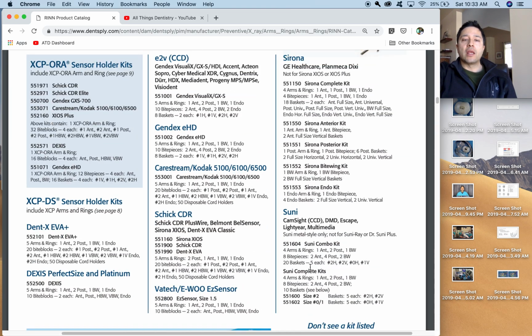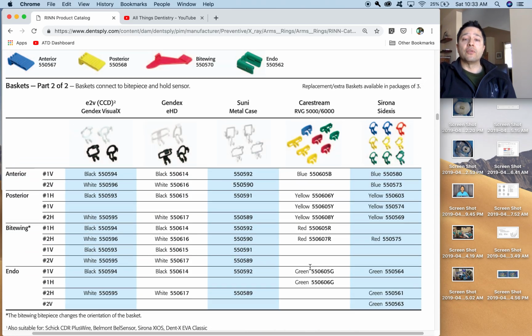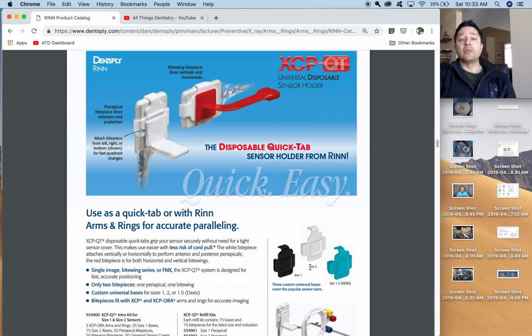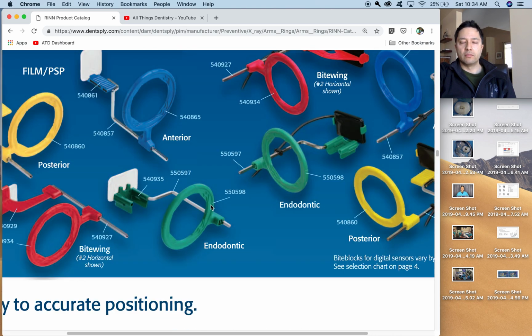What I didn't talk about, and I'd like to really quickly say, is that if you're using phosphor plates, because two of the other practices I work at routinely use phosphor plates. So we have these as well. And I need to say that I've been doing this for a while now, so I've gained a lot of experience. I've learned a lot, especially from my dental assistant, how to take really good X-rays.